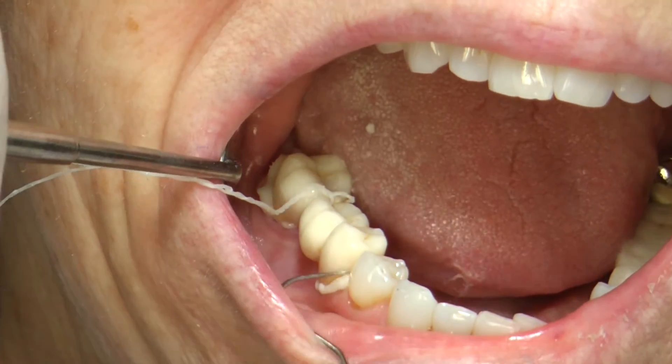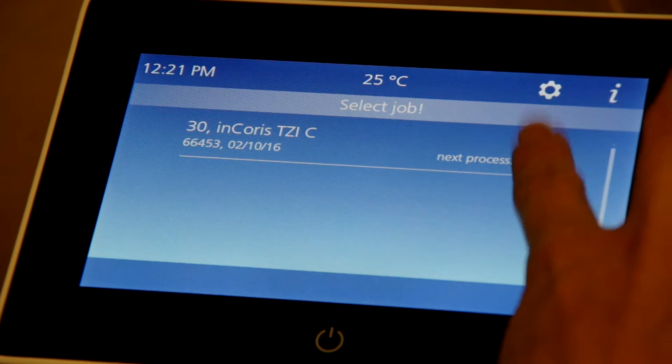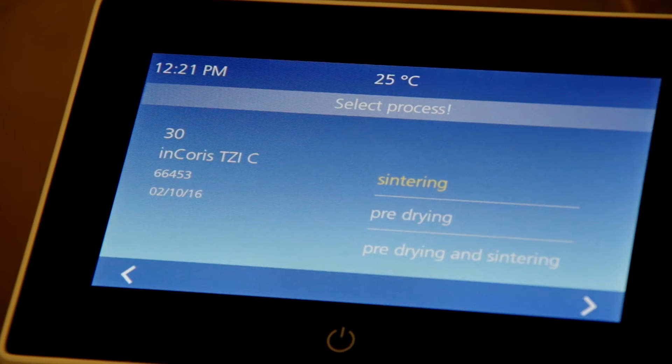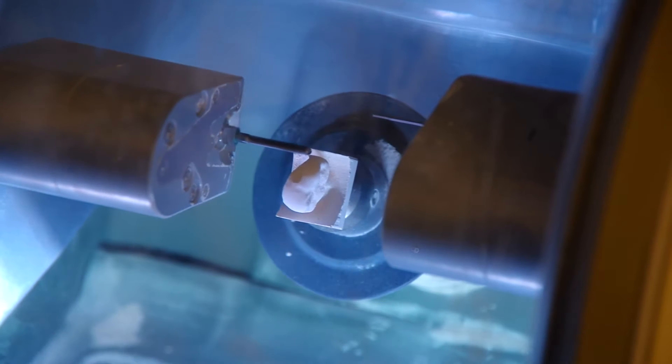What Sirona has been able to do is make it straightforward, make it simple. There's no guesswork. There's no thinking involved with this. In fact, the oven actually calculates the sintering time on the volume and size of what the restoration is. So every program is unique to that restoration. This is groundbreaking when it comes to clinical dentistry.